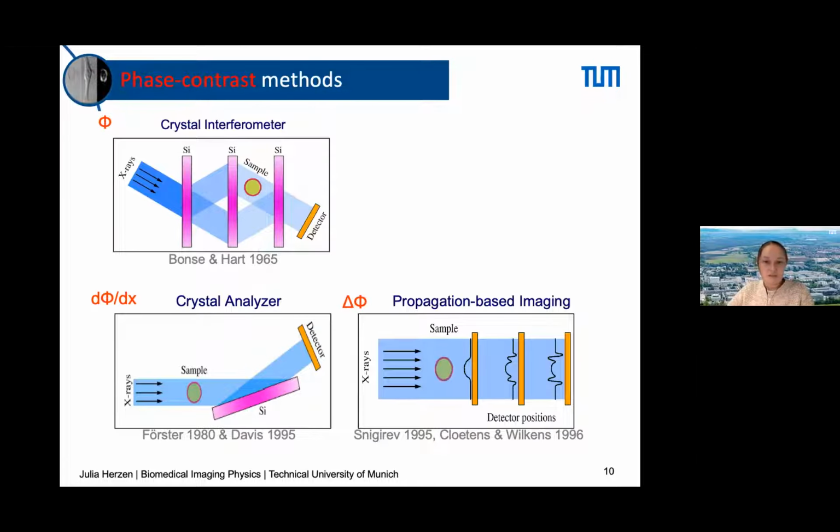And one of the most used, I think, if you go around the world to all these large scale facilities where you get coherent or brilliant illumination, and even in the labs, is a phase contrast method which is taking over, I would say, which is the propagation based. So you do not need any optics, no crystals or anything.